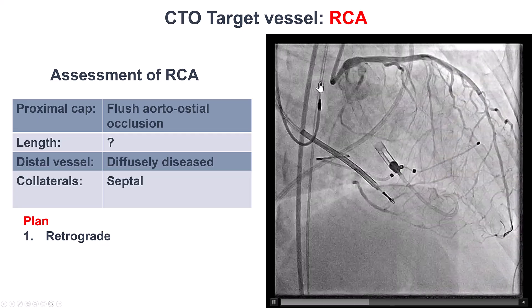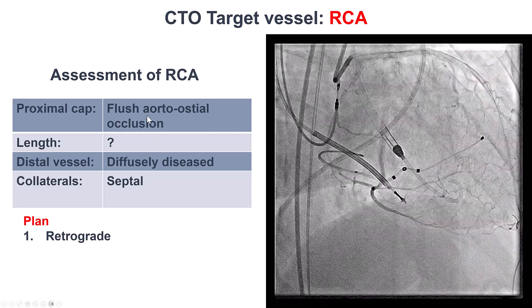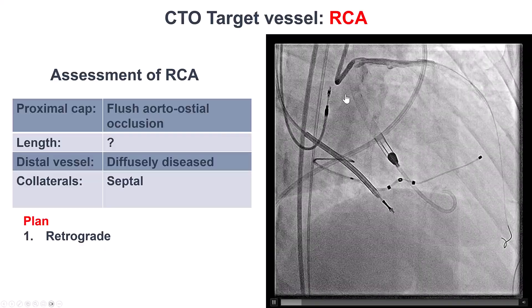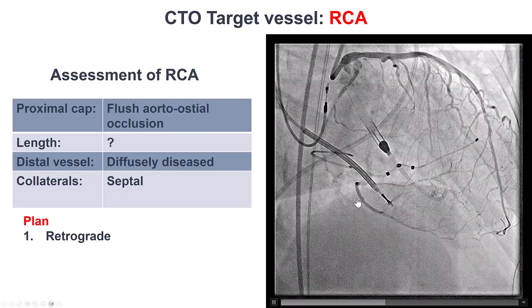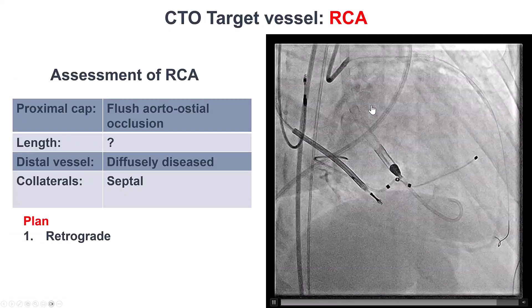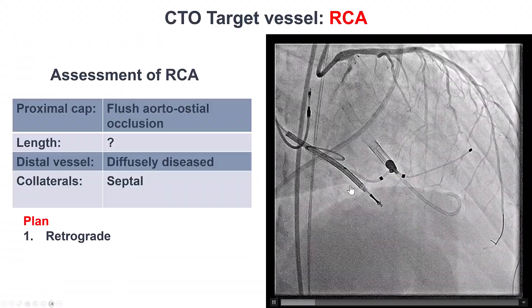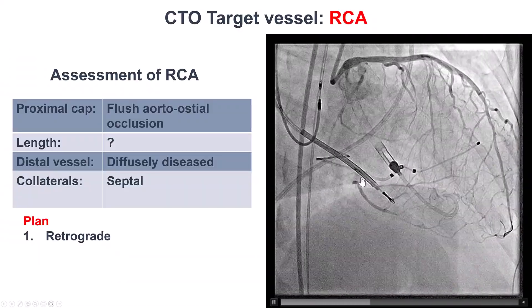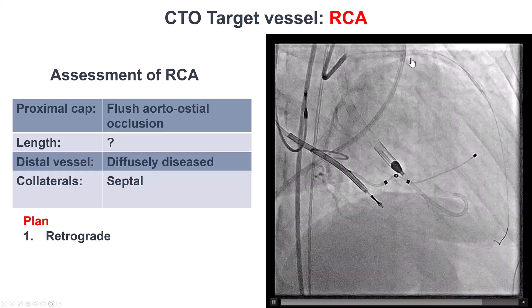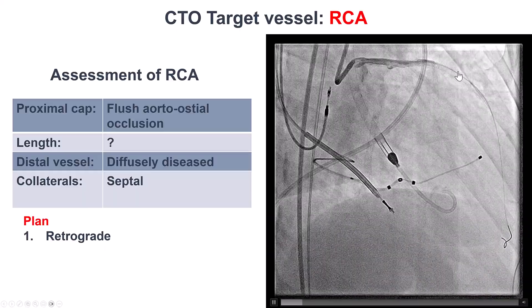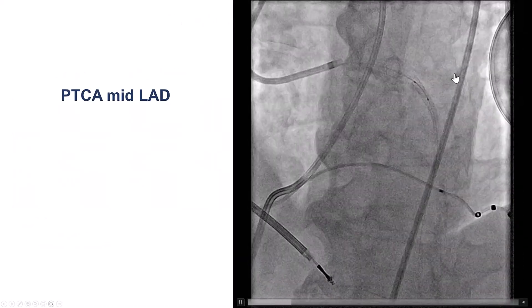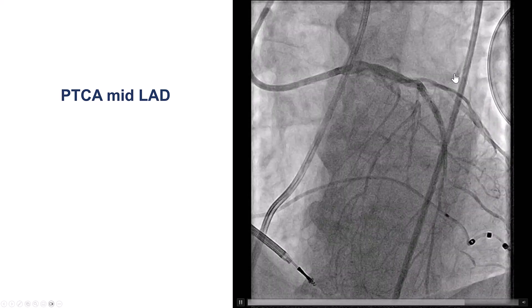What we have here is an aortoostial CTO of the right coronary artery. The length is unclear, but it's probably not too long because we do see filling of the right coronary artery all the way back to the proximal. The distal vessel has some diffuse disease, but overall it's not too bad, and there are septal collaterals filling from the LAD. The LAD itself had previous stents. Because of that, we had to go on a primary retrograde approach given the ostial occlusion.